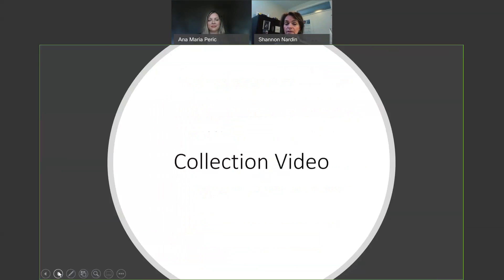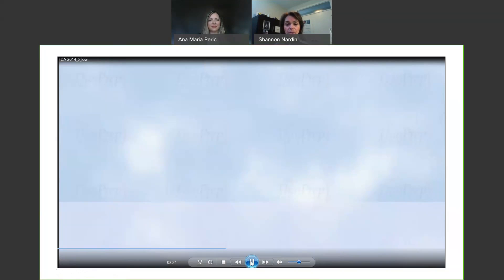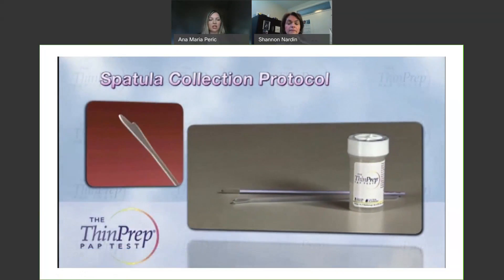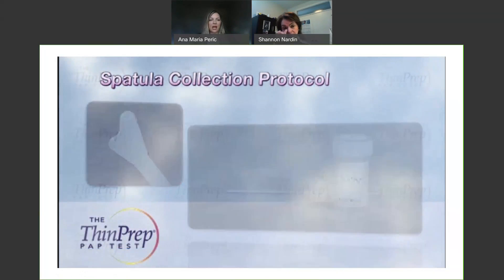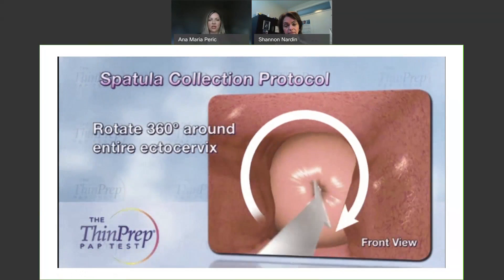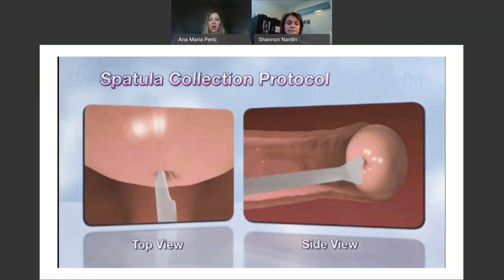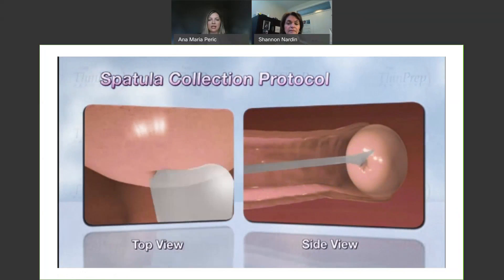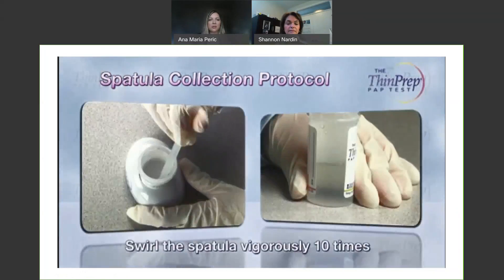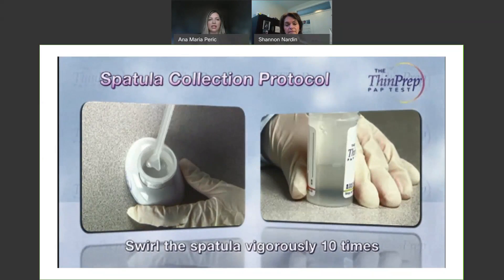As we are all visual learners, Anna Maria and I thought a short video would clarify what was just described. You're going to start with the spatula that looks just like the one you've been using, however it's plastic now. You're going to sample the ectocervix with a full 360-degree rotation — this shows a top view and a side view of that collection. Once you've got that sample, take the spatula and swirl it vigorously into the vial to try and get all of that material off and inside the liquid.